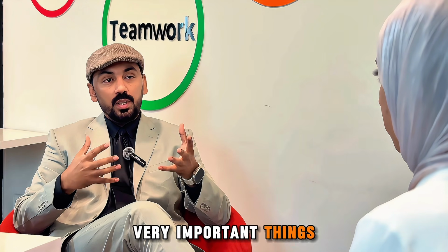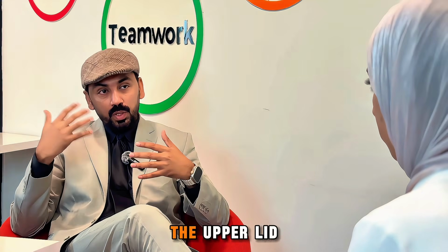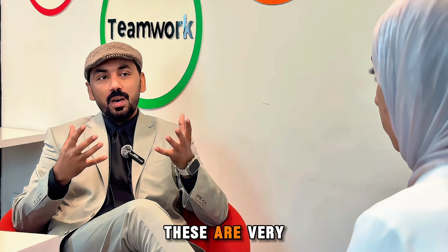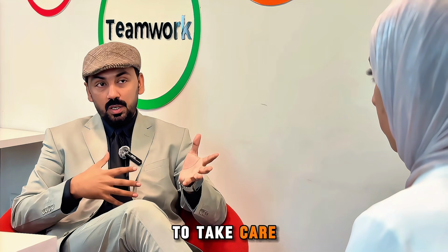These are very important things. Moreover, the lid tension, the upper lid tension, the tear film stability, and the blink control or blink pattern are very important factors which we have to take care of before inserting the soft toric contact lenses.